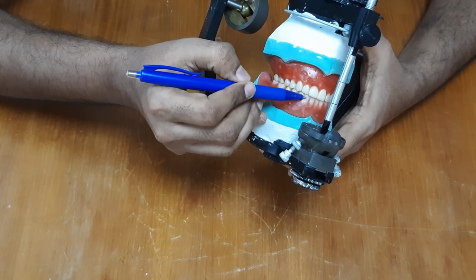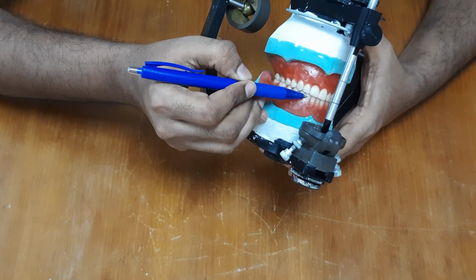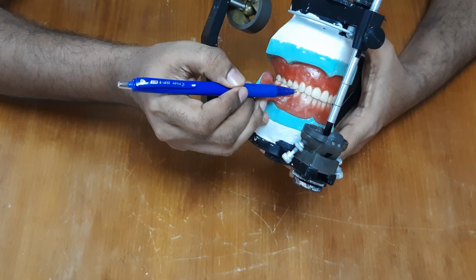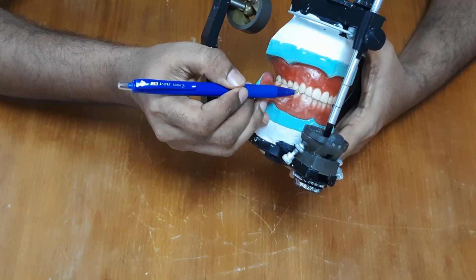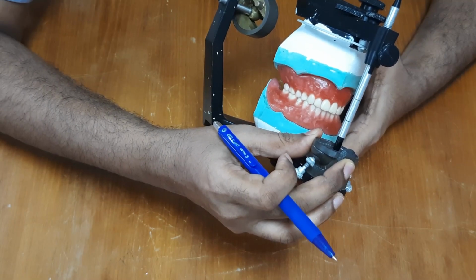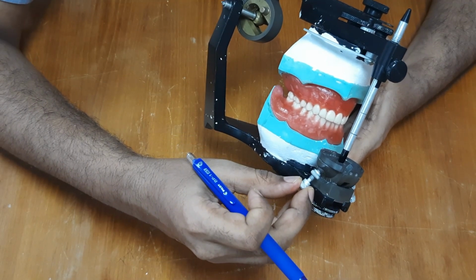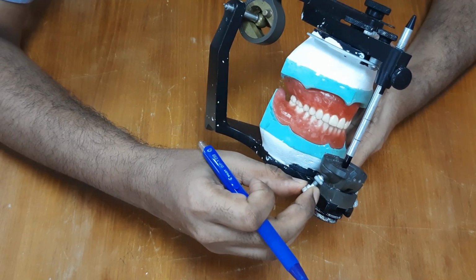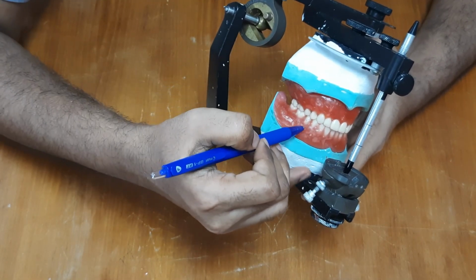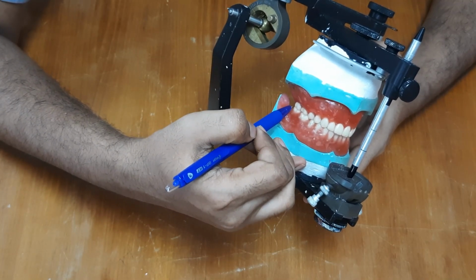After trial in the patient's mouth and making sure that there is anterior contact, edge to edge relationship, and then setting the canine also and checking the relationship in the patient's mouth, we transfer the rims back to the articulator. Then we adjust the incisal guide table by performing the movement and rotating the table anteroposteriorly and adjusting the lateral wing inclination also, so that there is contact of the table to the chisel end during the mandibular movements, after which we complete the setup of the posterior teeth in balanced occlusion.